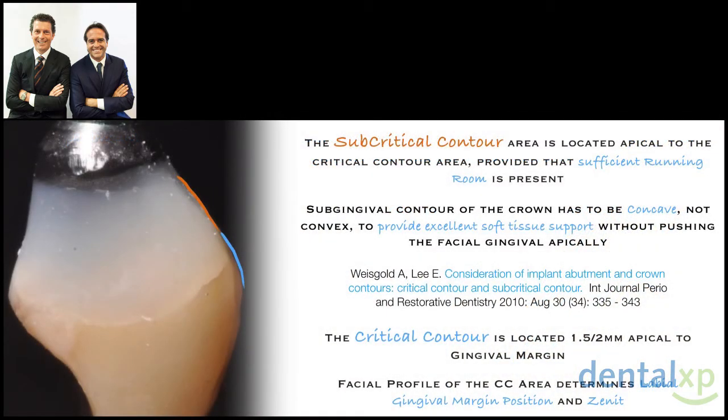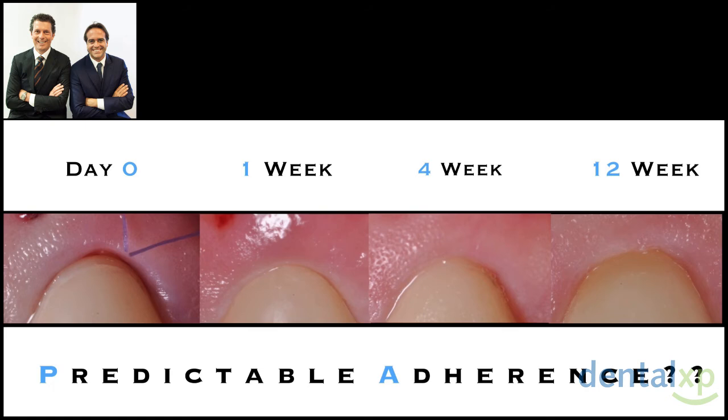Yes, 2 different zones between the implant abutment and crown are defined as critical and subcritical. Any alteration of these 2 areas can modify the soft tissue profile, including the gingival margin level, papilla height, gingival architecture, labial alveolar profile, and gingival color. And as you can see here, proper implant placement is key in order to create this smooth emergence profile with subcritical and critical contour. We need to get this adequate running room, and also we should do what? Smoothing and steam cleaning the provisional restoration will improve the soft tissue response and the epithelial attachment.